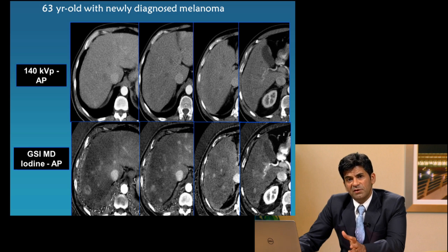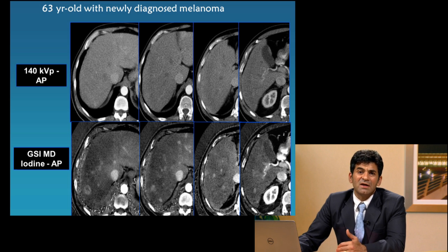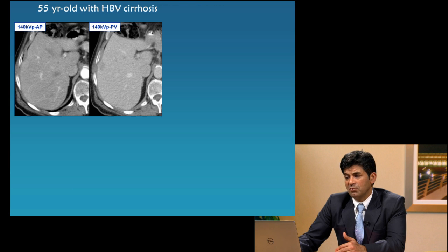On single energy images, we rely on the composite attenuation of the tissue as well as the iodine within the pathologies, whereas on iodine images, we are looking at the distribution of iodine. Therefore, the contrast to noise is better, enabling better visual detection of these subtle abnormalities.